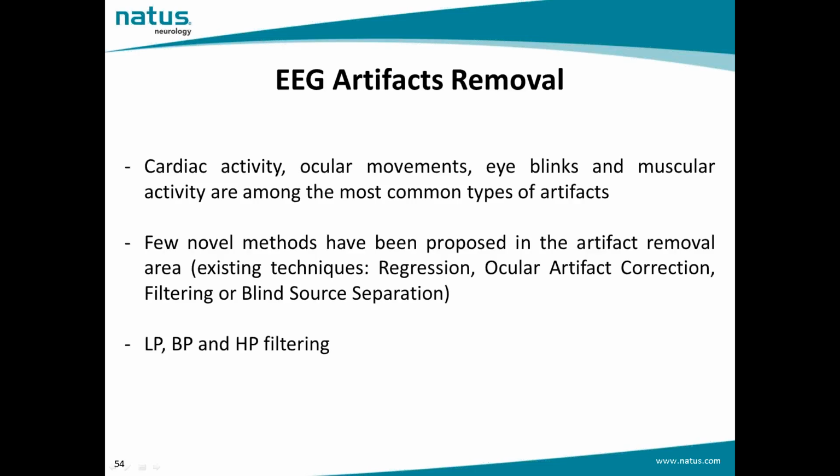Due to the sources of noise being very diverse and having different characteristics, most researchers focus on removing single types of artifacts. The cancellation of noise and artifacts is an important issue in EEG signal processing and normally a prerequisite for the subsequent signal analysis to be more reliable. For clinical applications, raw signals may still suffice to separate groups of good and bad prognosis, but other applications in research require data as artifact-free as possible.